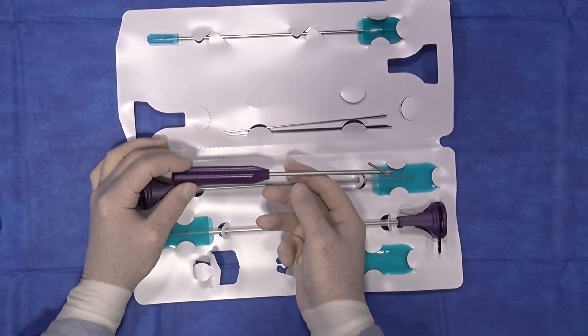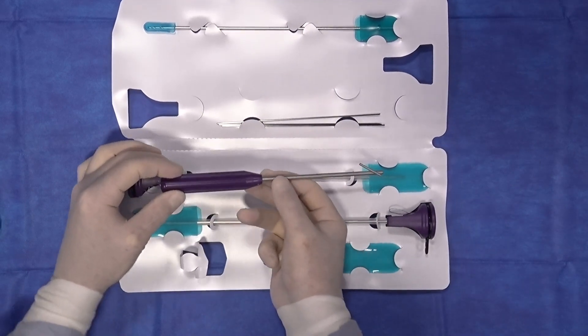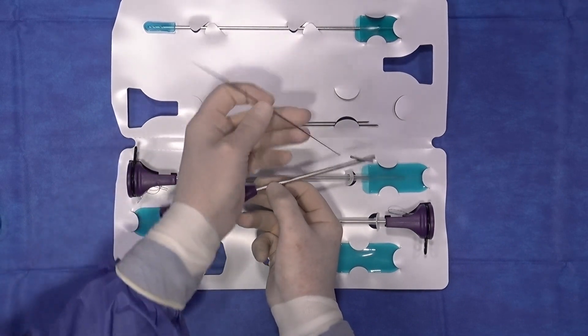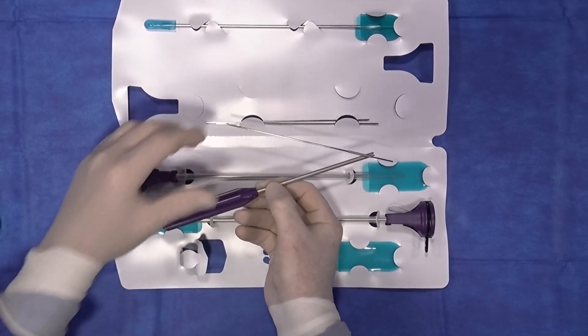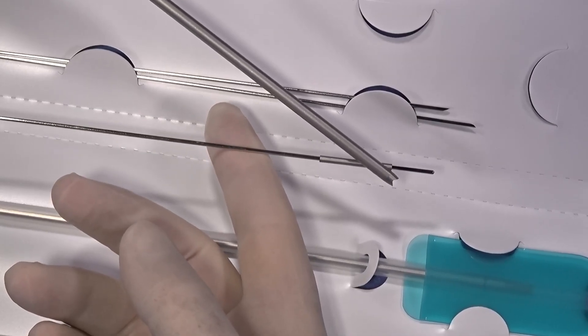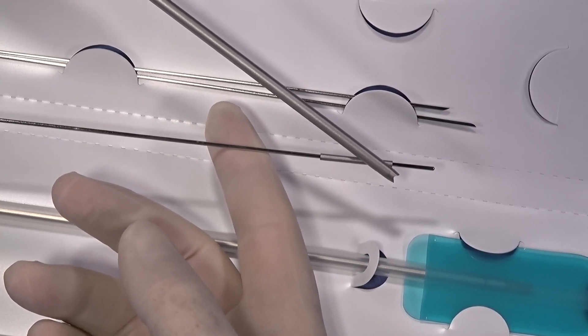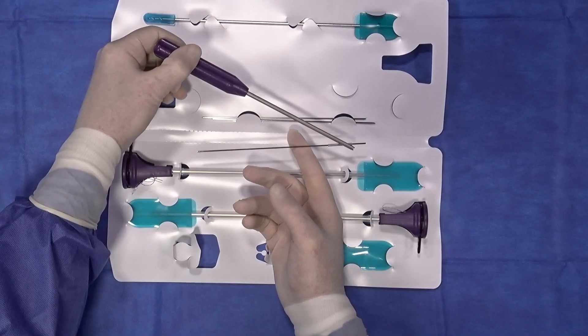This guide has a narrow channel which goes over the guide pin. The guide pin will be parallel to the surface of the joint, placing us at the appropriate angle and three millimeters below the articular surface of the articular cartilage of the tibia, ensuring safe and reproducible drilling.